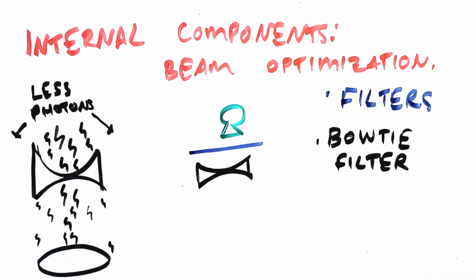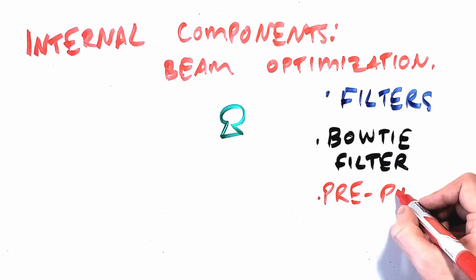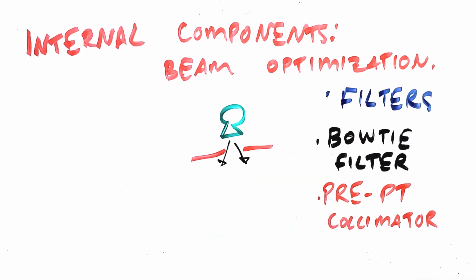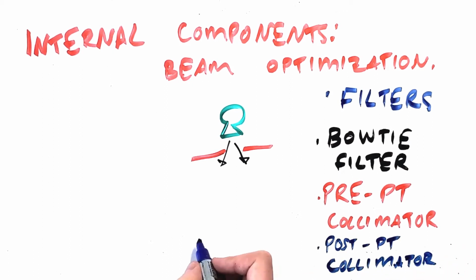periphery. As in conventional X-ray, there is a collimator between the tube and the patient which shapes and defines the edges of the X-ray beam leaving the tube. And unlike conventional X-ray, there's also a post-patient or pre-detector collimator which aligns to the edges of the detector area being used, again shaping the beam before it hits the detector and absorbing scatter radiation to improve image quality.